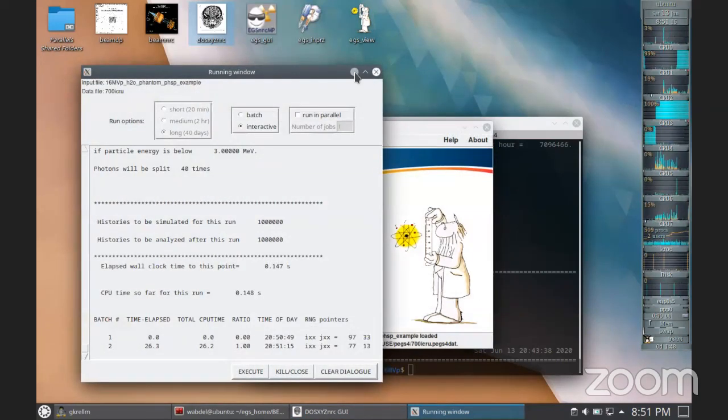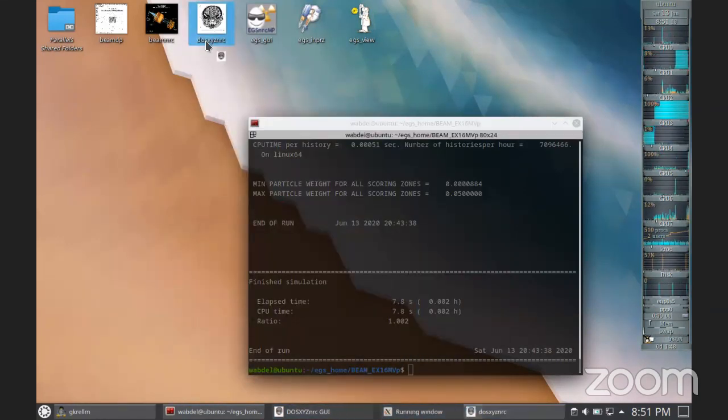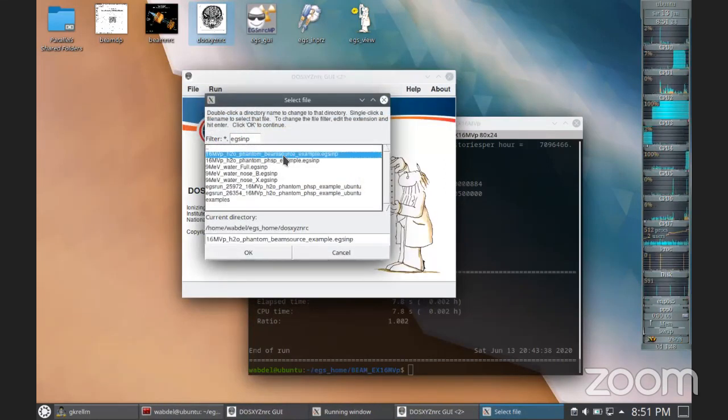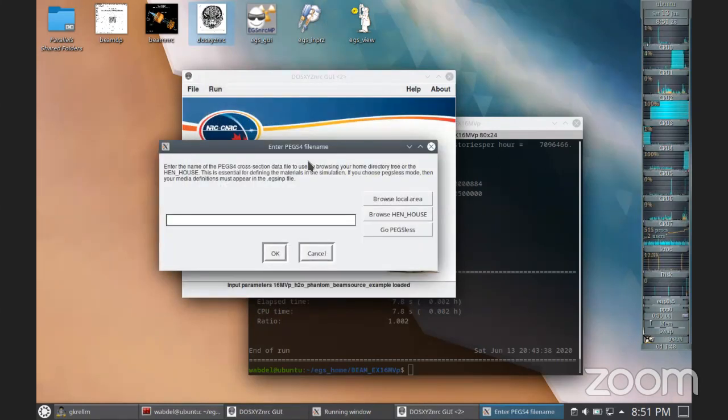While this is running, let's open another one. Okay. And let's open this other one, the beam source. So this is the advantage of using a beam source rather than a phasespace file: the more histories you get, you will not be limited by the uncertainties in your phasespace file. Because in a beam source, whenever you need a history, it will model with the linac and get your particle. The disadvantage is that, of course, it's going to take time to get a particle from the beam simulation.